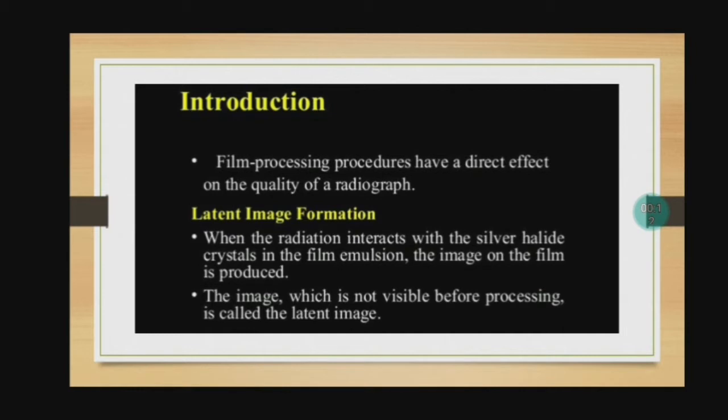Latent image formation. When radiation interacts with the silver halide crystals in the film emulsion, the image on the film is produced. The image which is not visible before processing is called the latent image.